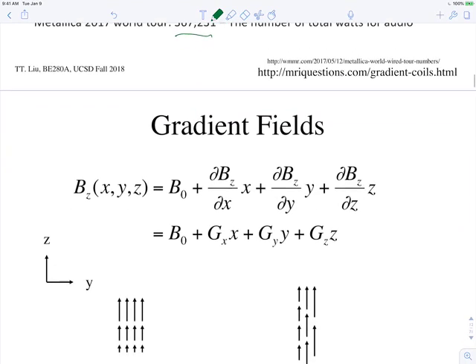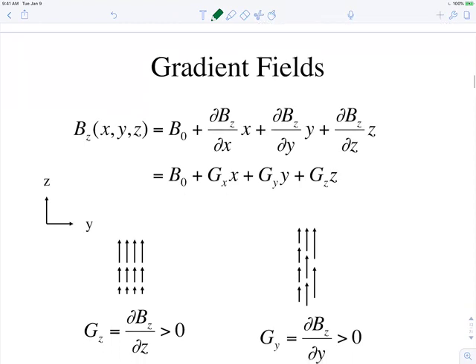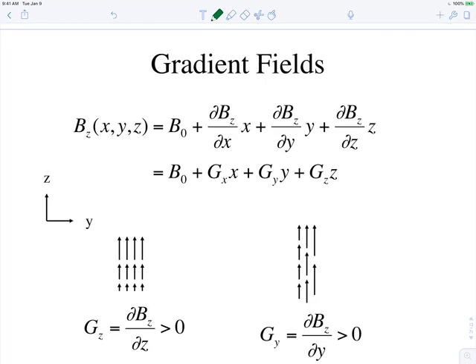So we're going to take some time to work through some of the mathematical notation and then get back to how we apply it with pulse sequences. The first thing is to make sure everyone's on the same page in terms of what we mean by the gradient.